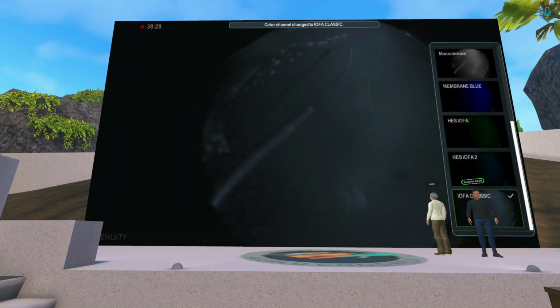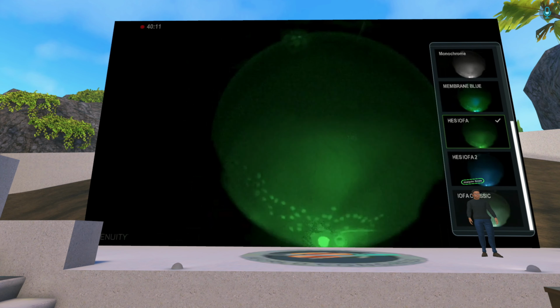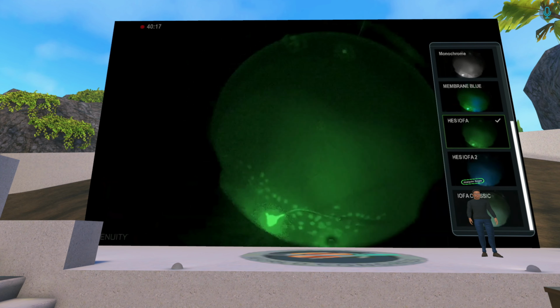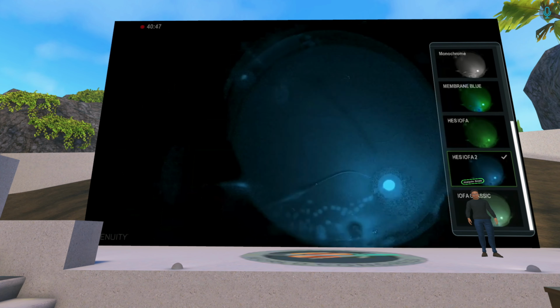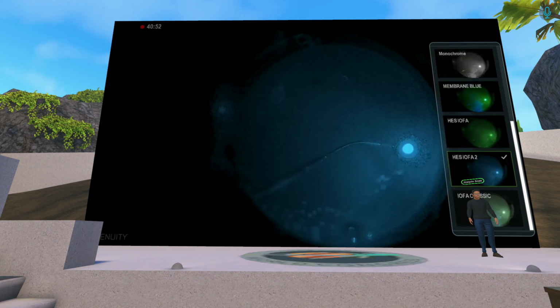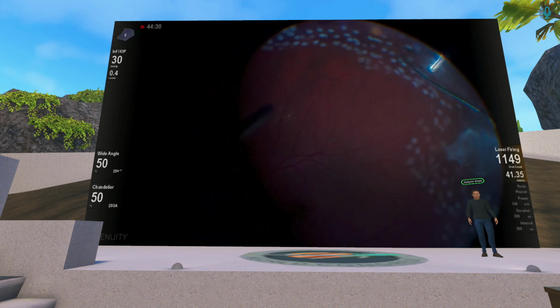When we change into Intraoperative, you can notice significant peripheral ischemia that was first delineated and then treated with conventional laser. I think this is a very useful technique because let's remember that blue light is toxic to the retina, so you will want to diminish the time you use the blue light in the eye. So you first delineate and then you complete the laser to the ora, as was done in this case. We get a lot of sickle cell retinopathy here in the Dominican Republic.